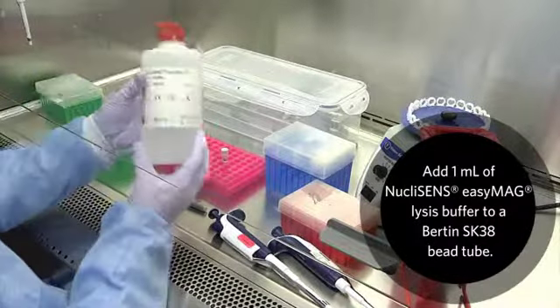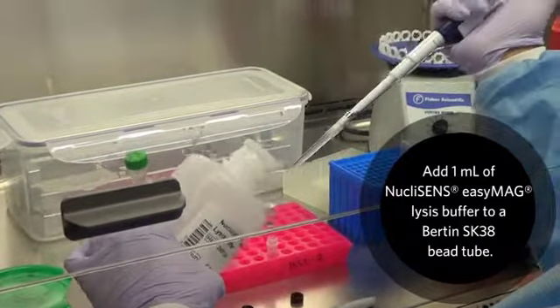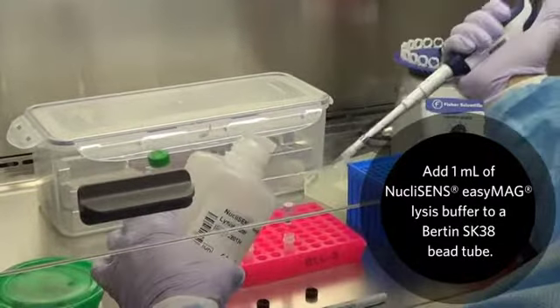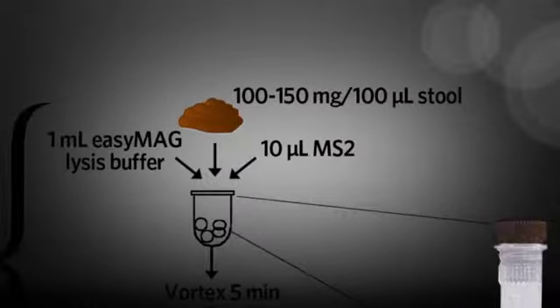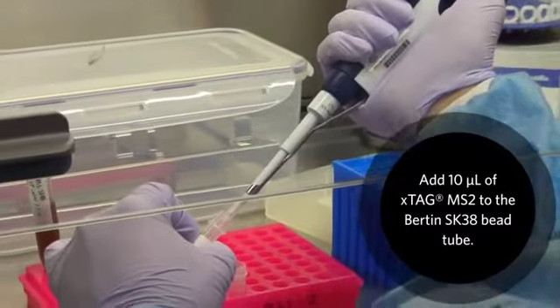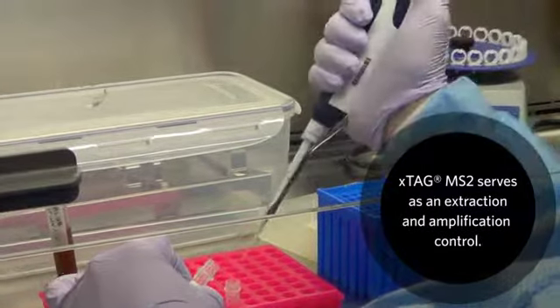Add 1 milliliter of NucliSENS easyMAG lysis buffer to a Bertin SK38 bead tube. Add 10 microliters of xTAG MS2 to the Bertin SK38 bead tube. xTAG MS2 serves as an extraction and amplification control.